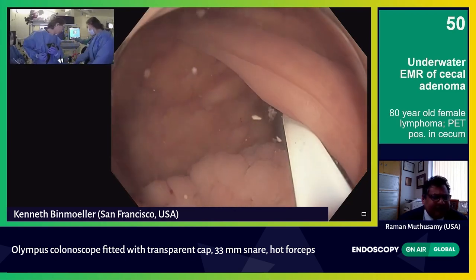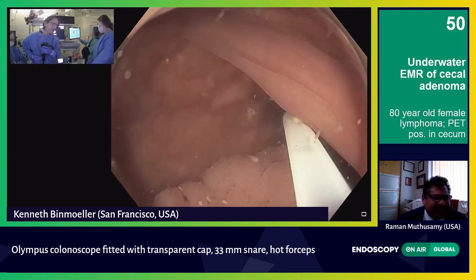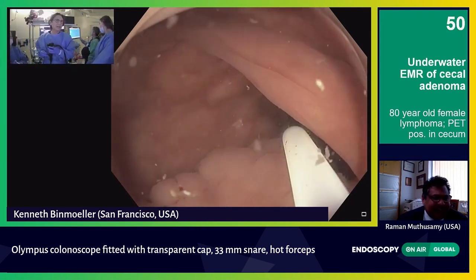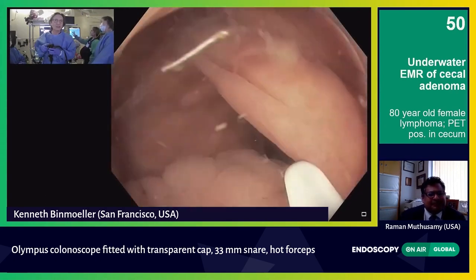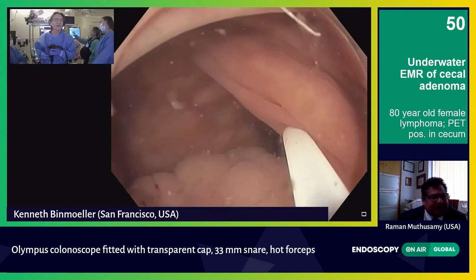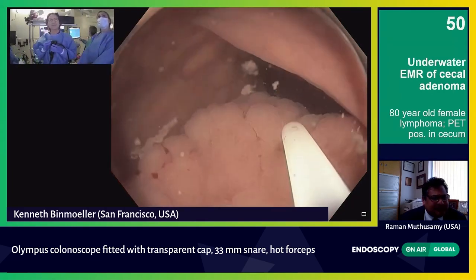Let me check that myself — yes, auto-cut, effect 5, and then force coag if I need to coagulate. Now, this is a very vascular lesion, so I do expect to encounter some bleeding afterwards. We have our hot biopsy forceps ready.